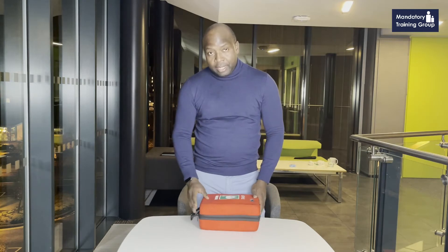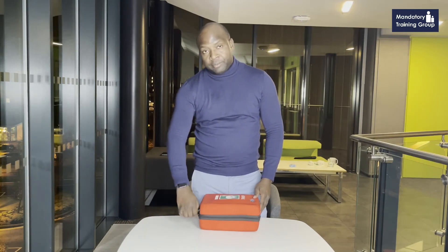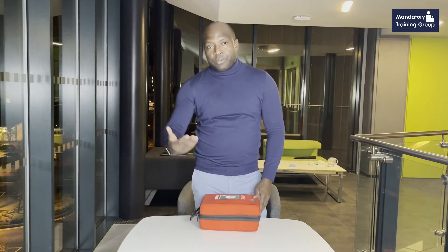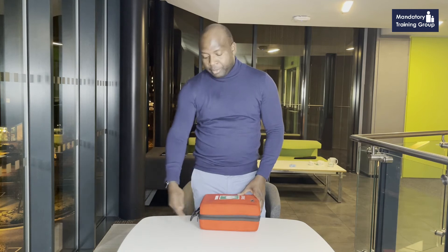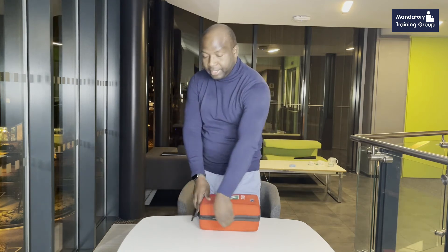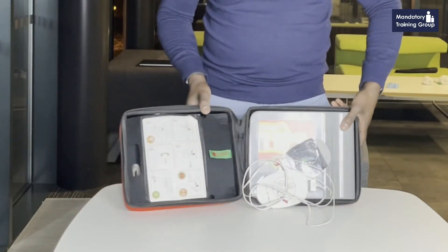With AEDs, the key before you use it is to cut the seal — you have to remove the seal. Whenever we use it or update the items inside, we have to put a seal back to confirm it's been checked and everything is there correctly. So open the AED and you'll see something like that.